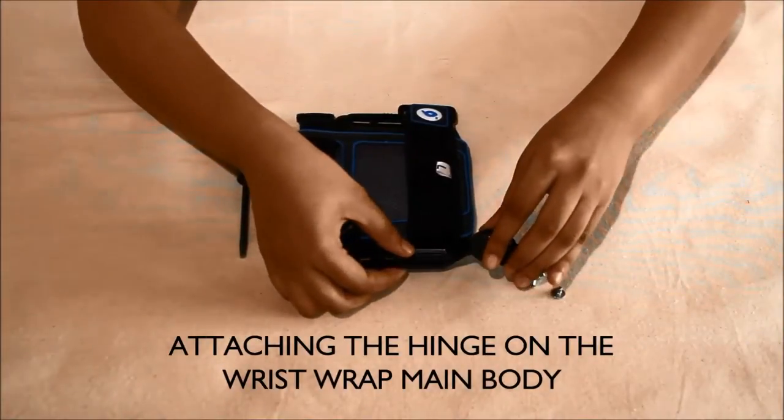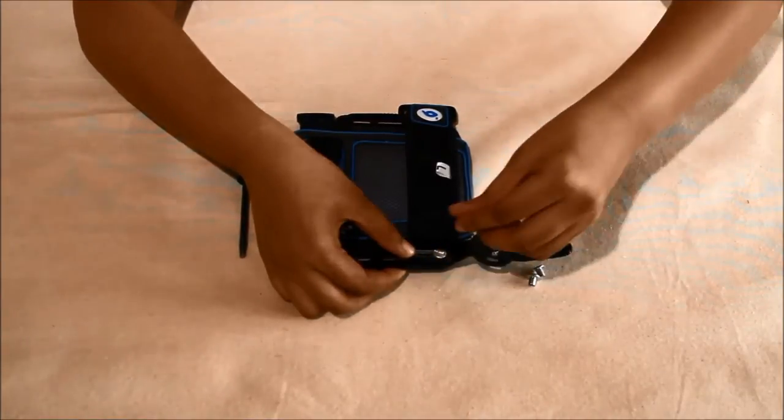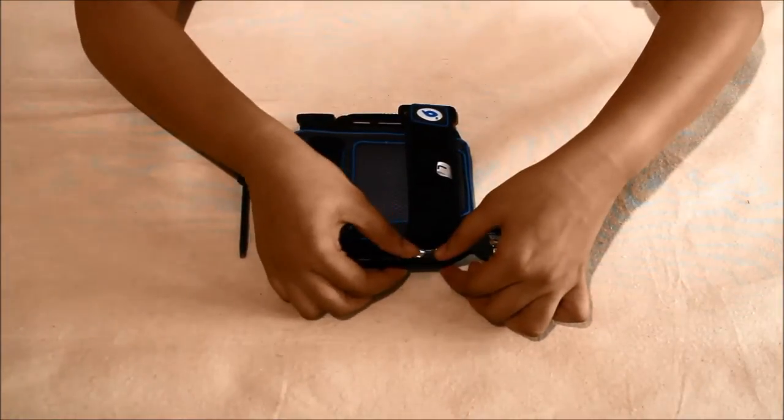Attaching the hinge on the main body: place and fix the hinge on the plastic hinge rail affixed to the main body of the wrist wrap with a slot pan head screw.